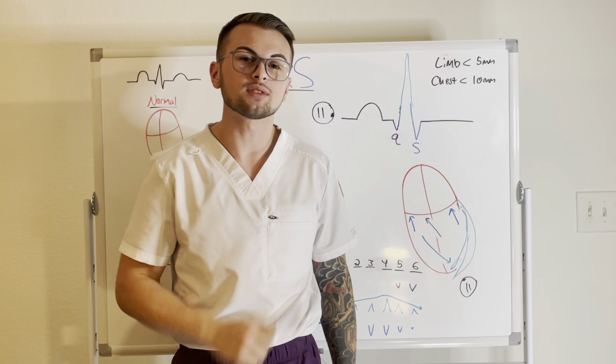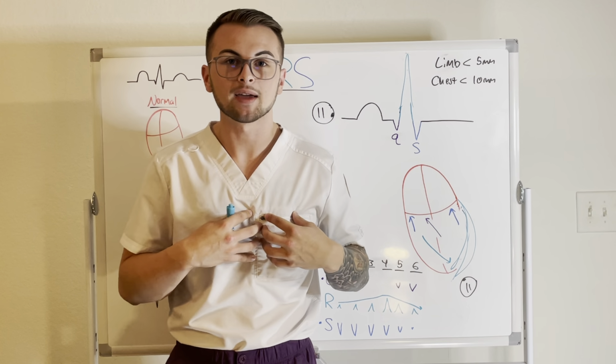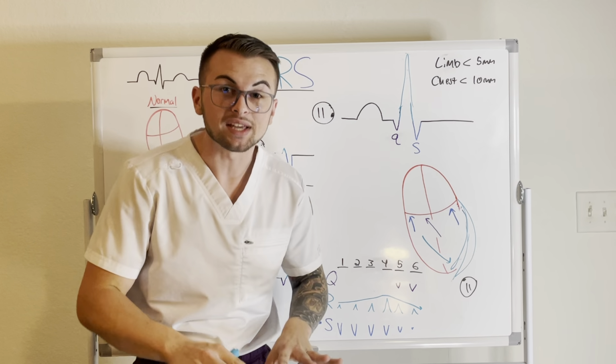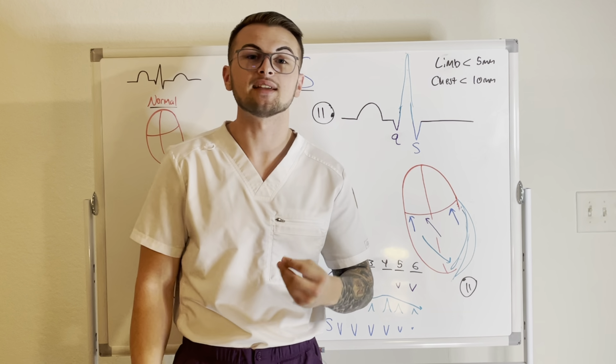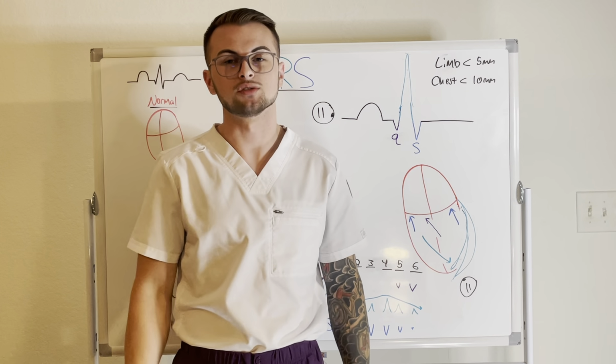Now, some important things to remember about the QRS amplitude is that younger, skinnier men will have greater amplitudes, while older, obese women have smaller amplitudes. And please don't forget that the chest leads will likely have greater amplitudes because they are closer to the heart.